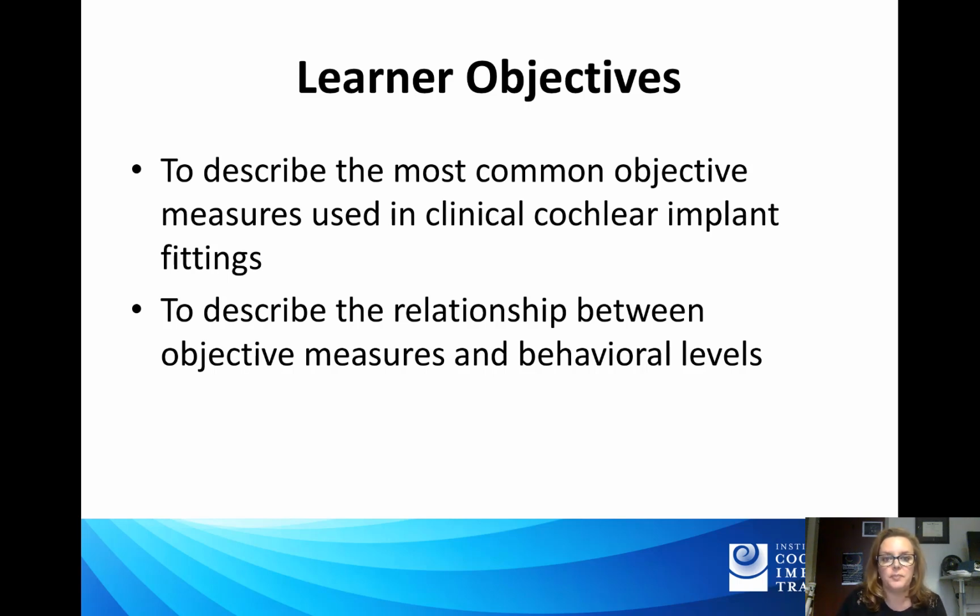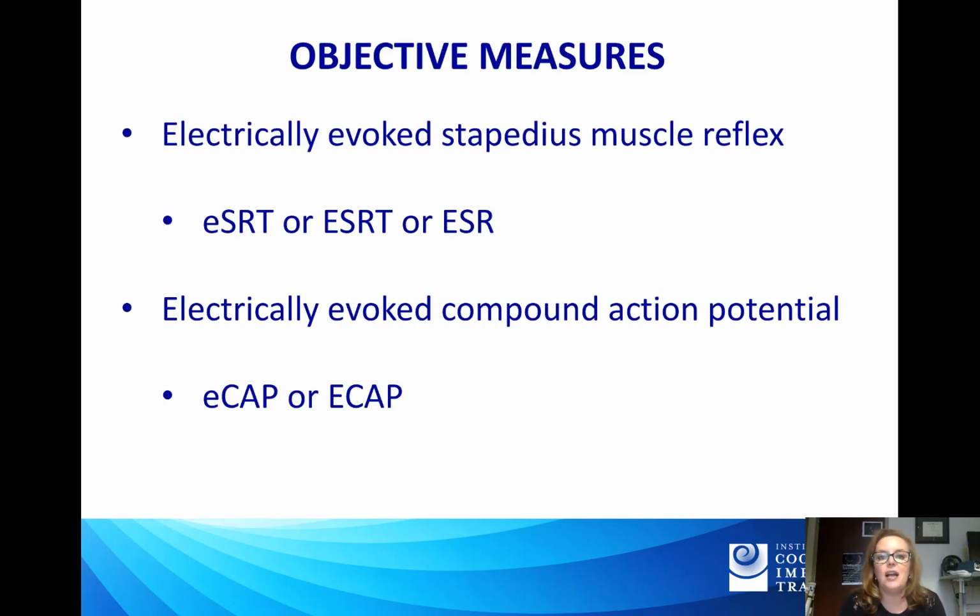stimulation levels. So moving right along, first we're going to focus on the electrically evoked stapedius muscle reflex, or ESRT. And I've seen it with little e, big E, I've seen just ESR. I'm going to just be referring to this as ESRT from this point forward.